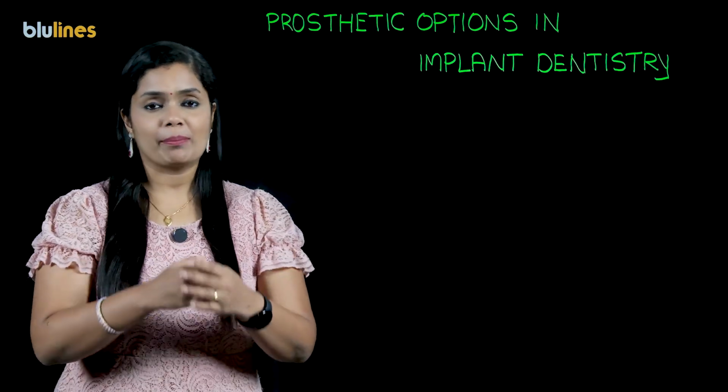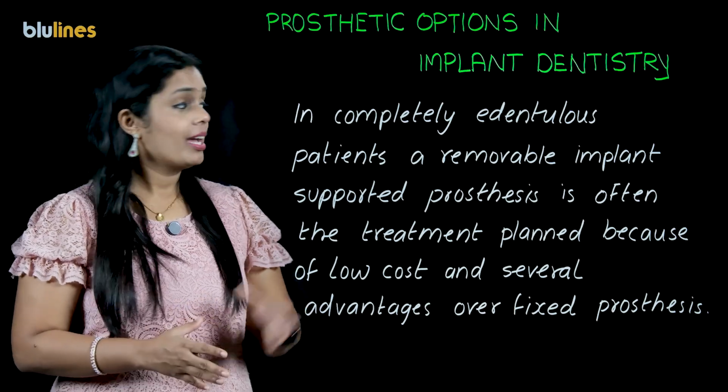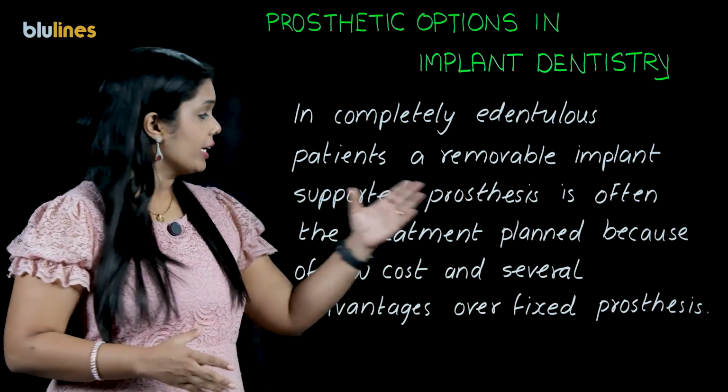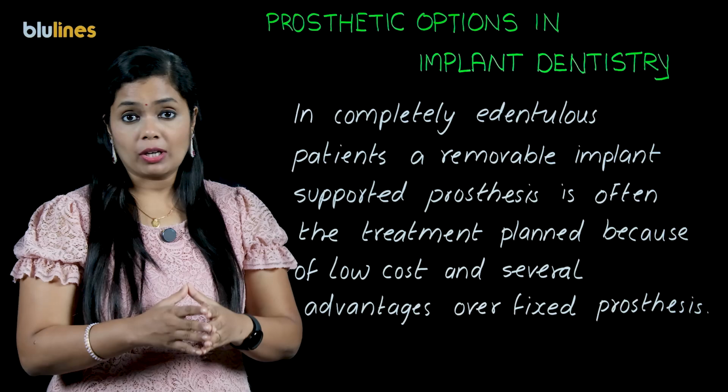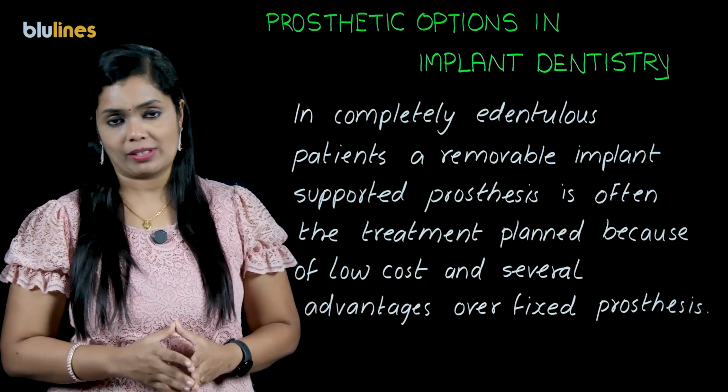Prosthetic options in implant dentistry. In completely edentulous patients, a removable implant prosthesis is often the treatment plan because of its low cost as well as several advantages over fixed prosthesis.